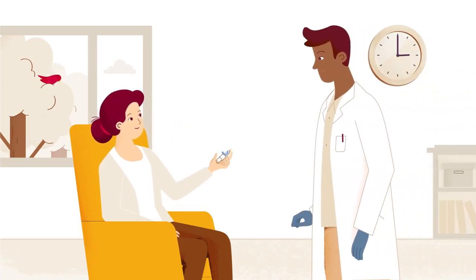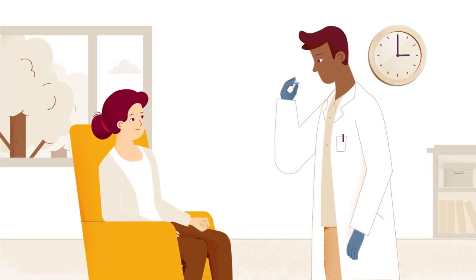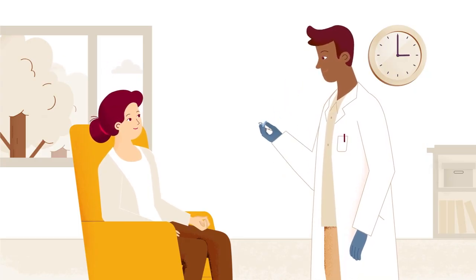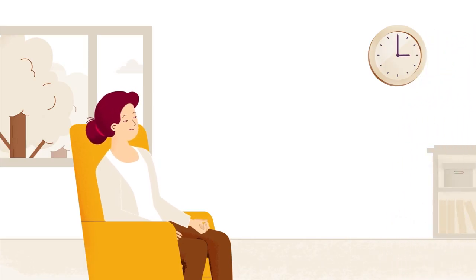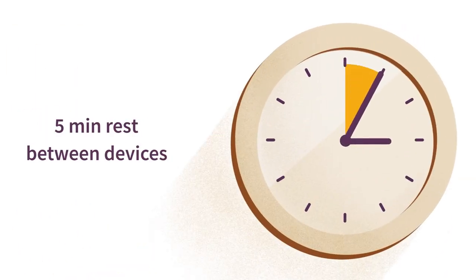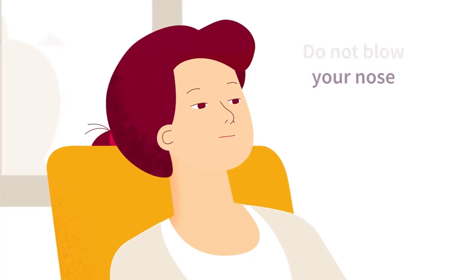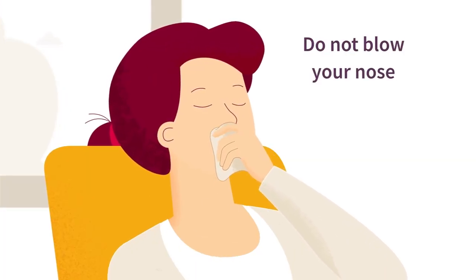After administering Spravato, your healthcare provider will check the indicator window to ensure there are no green dots, confirming that all the medication has been administered. It's important that you rest in a comfortable position, preferably semi-reclined for 5 minutes between devices to allow the medication to absorb. Do not blow your nose. If liquid drips out, dab your nose with a tissue.